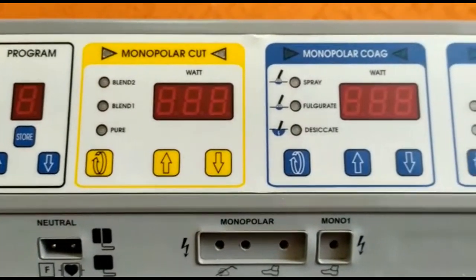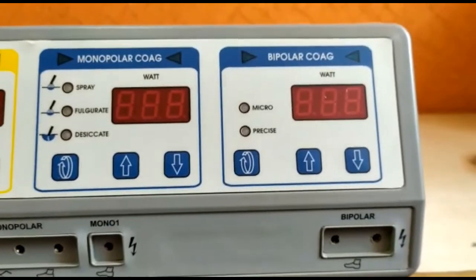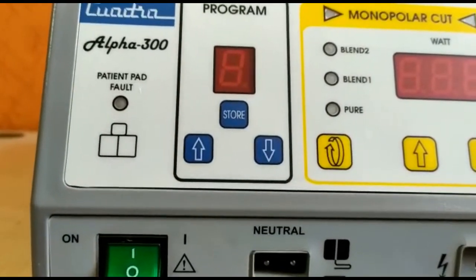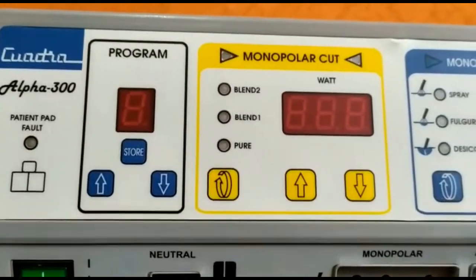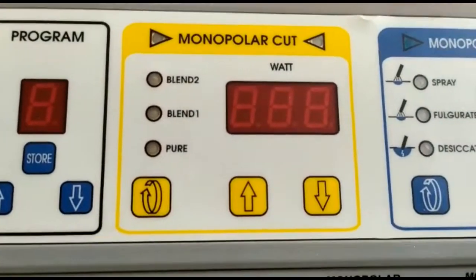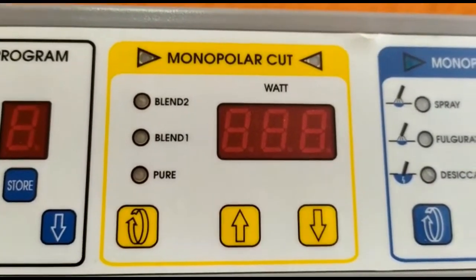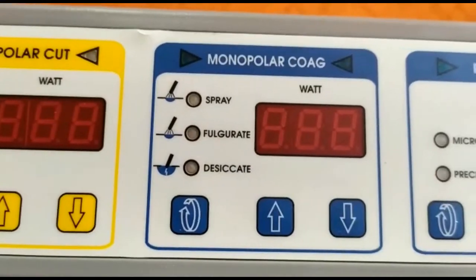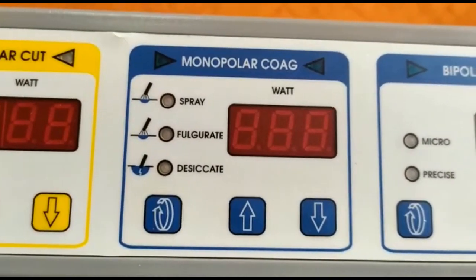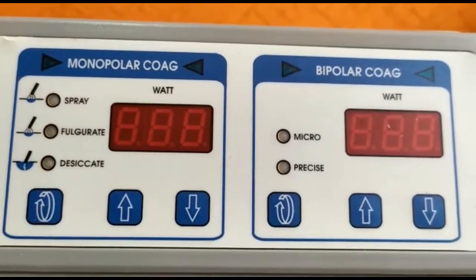The Alpha Series is known for an optimal set of features, ease of use, and advanced safety for the patient plate. Different surgeons can store their favourite settings in different programs. Monopolar cut has pure cut and 2 types of blends. Monopolar coagulation has 3 modes: desiccate, fulgurate, and spray. Bipolar coagulation has precise and micro modes.